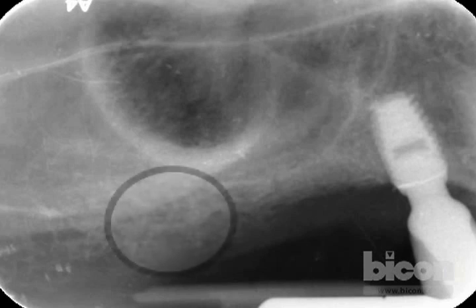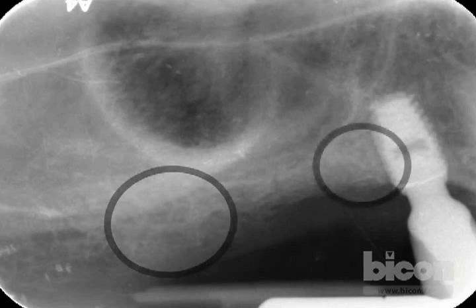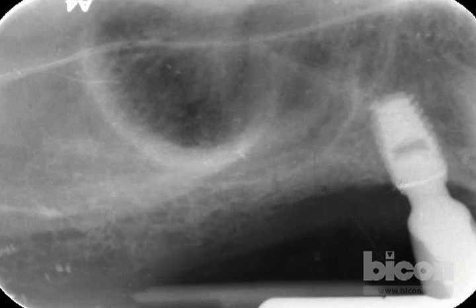As you can see, the bone in the area of the first and second molars is a little bit thicker, and the bone immediately next to the implant is also thicker. So the window will have to be about 3 to 4 millimeters posterior or distal to this implant, and will end right about the area where a tooth used to exist a few months back. The design of the flap I will show you. Do you have any questions before we start?